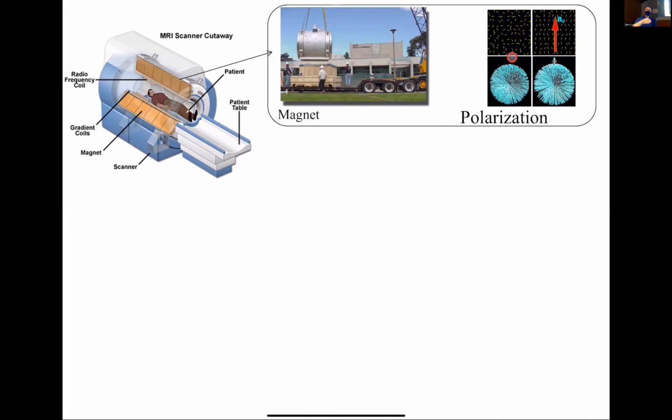The other extreme is saying, well, why don't we go the other way? Let's go to lower field. We have less signal, but let's use deep learning and other tricks to get around that. So there's two ways of going around the problem. And obviously in the middle, there's no reason you can't apply deep learning to things at 3 Tesla or 4 Tesla. It's just that the gains tend to be less.